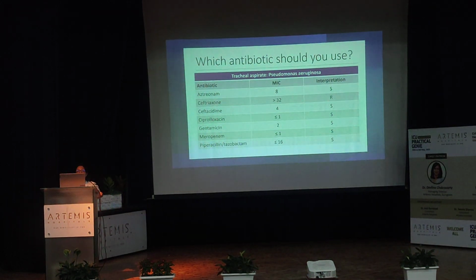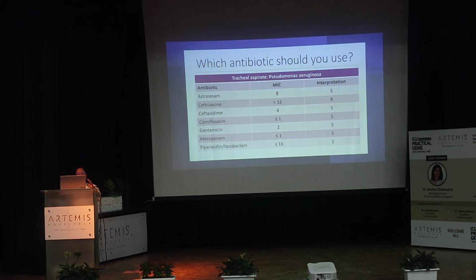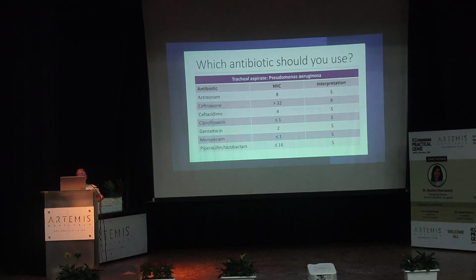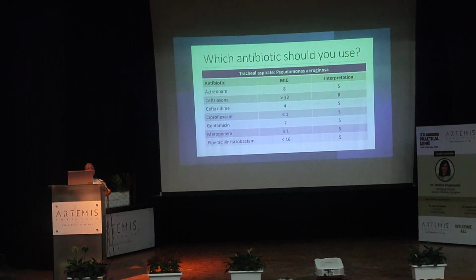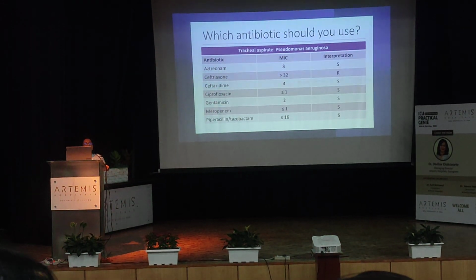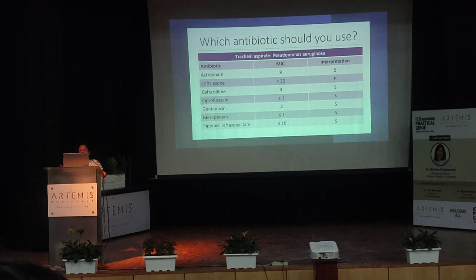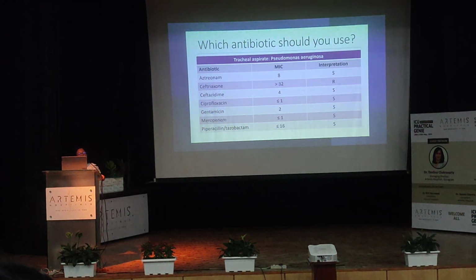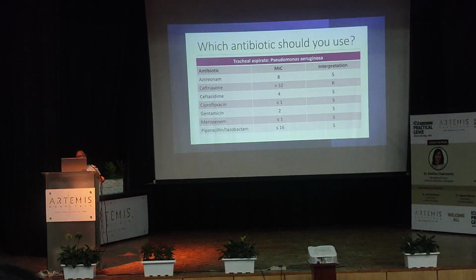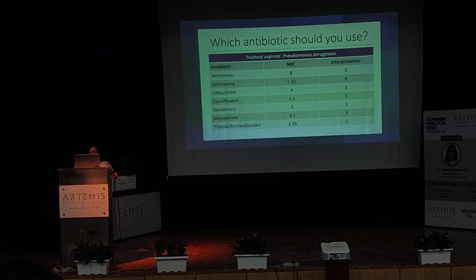Our first step should always be to start with beta lactams. Is there any beta lactam sensitive in this culture report? Yes, ceftazidime sensitivity is there. Piperacillin, this is a penicillin. Penicillins also have intrinsic Pseudomonal activity, piperacillin-tazobactam and ticarcillin. These drugs have Pseudomonal activity. Here we can see sensitivity towards piperacillin and tazobactam is there. So the first drug of choice should be a penicillin or any beta lactam antibiotic.